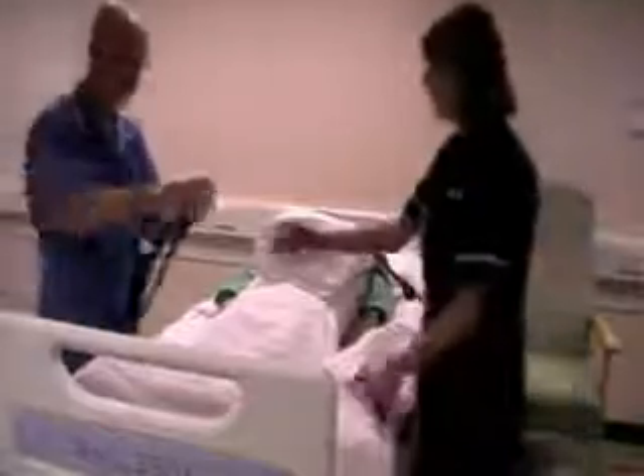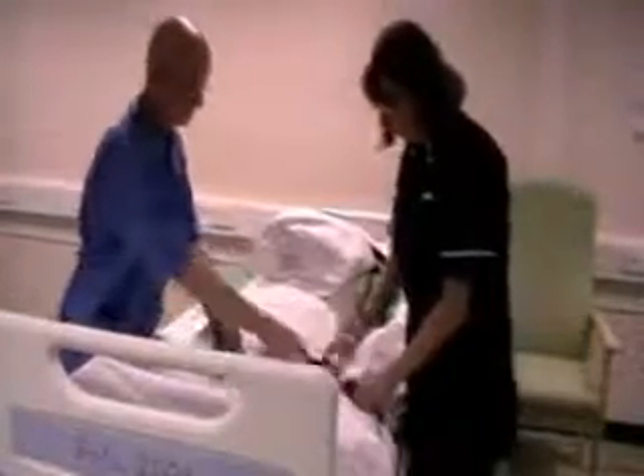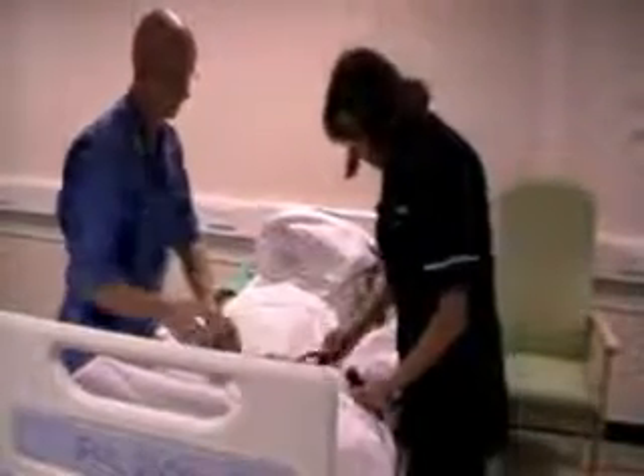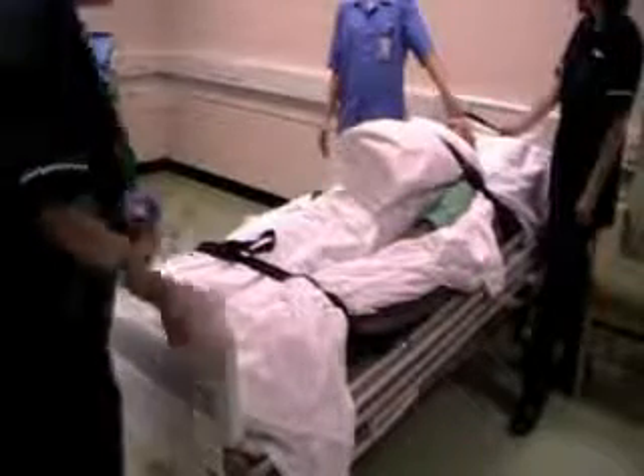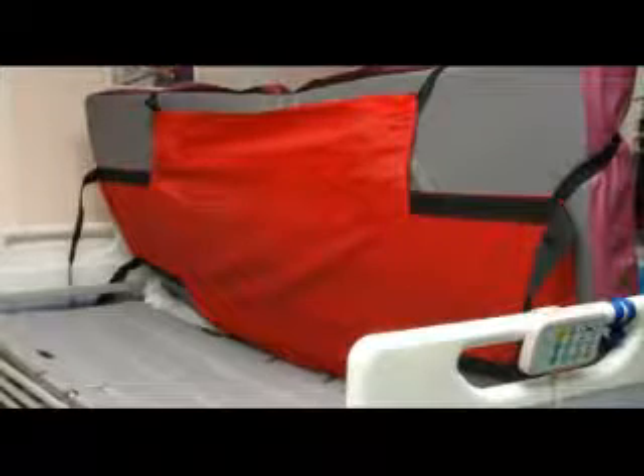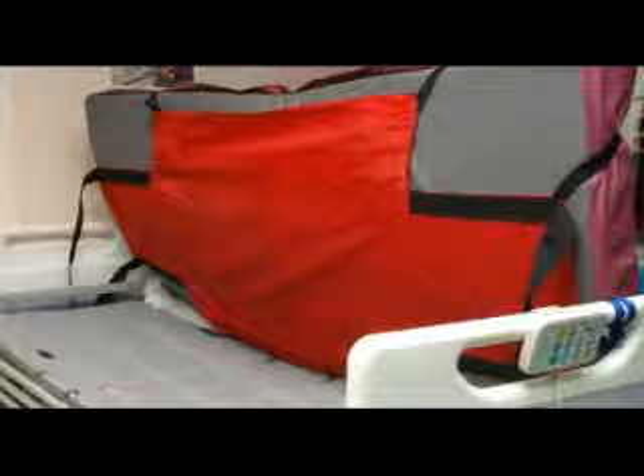Ski sheets and ski pads are used for emergency or vertical evacuation, prior to which you will have performed progressive horizontal evacuation to a stairway using a patient bed or trolley. We are going to show you the use of a ski sheet first, which are used with static mattresses, and then the use of a ski pad, which is used with a dynamic mattress for evacuation of dependent patients.